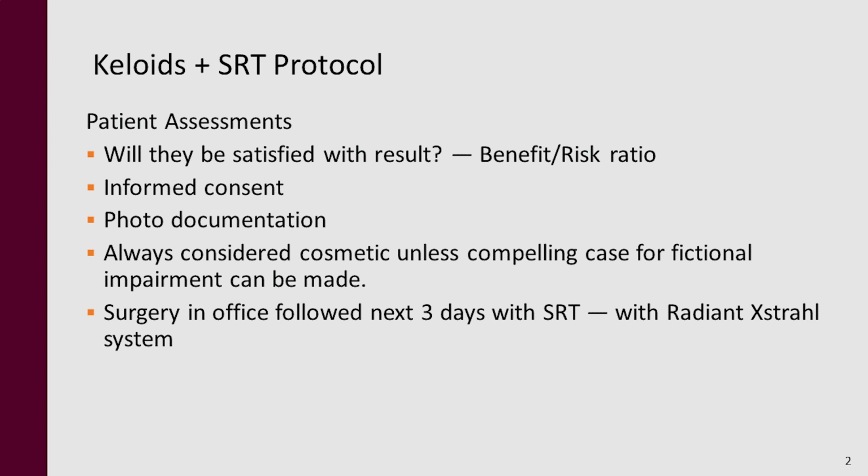Of course, photos are very important. Good photo documentation. In our practice, we always consider a keloid cosmetic unless we can really make a case that it's a functional problem.